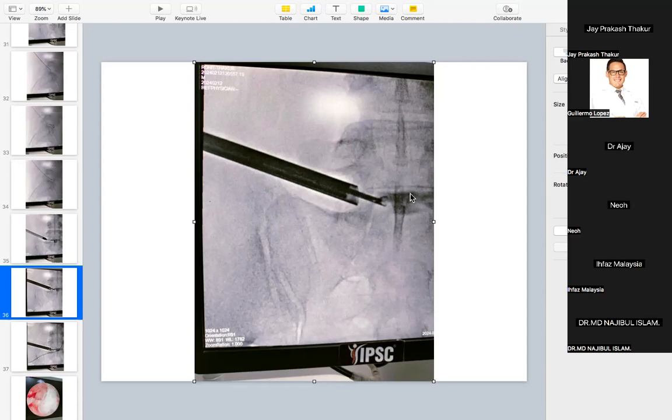So if the central herniation is there, it becomes difficult to remove from the foramen in this case, if it is purely central. If it is central, extended to the paracentral, you can remove it from there. You can extract it from there.